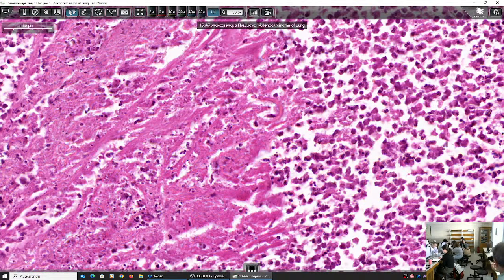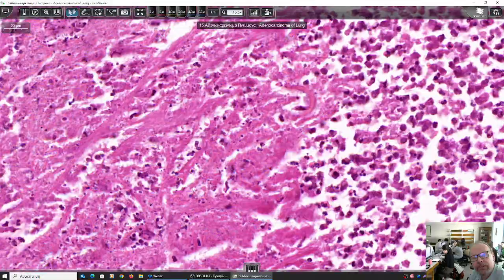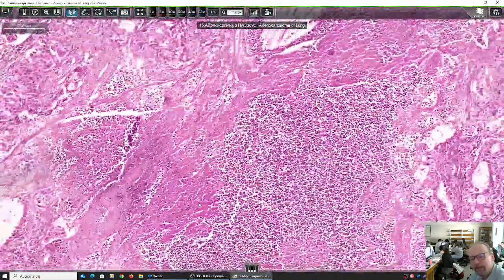If a tumor becomes necrotic, it means that its neovascularization is not enough to give enough blood supply, so it becomes necrotic. Yes, but the necrosis should be somehow geographical. That means not throughout the tumor, because if you see a tumor that is throughout necrotic, this might have to do with something irrelevant to the biology of the cells, something like an acute happening. Do we call this nuclear debris again? Yes, it's debris here. This is the debris, nuclear debris, nuclear dust.